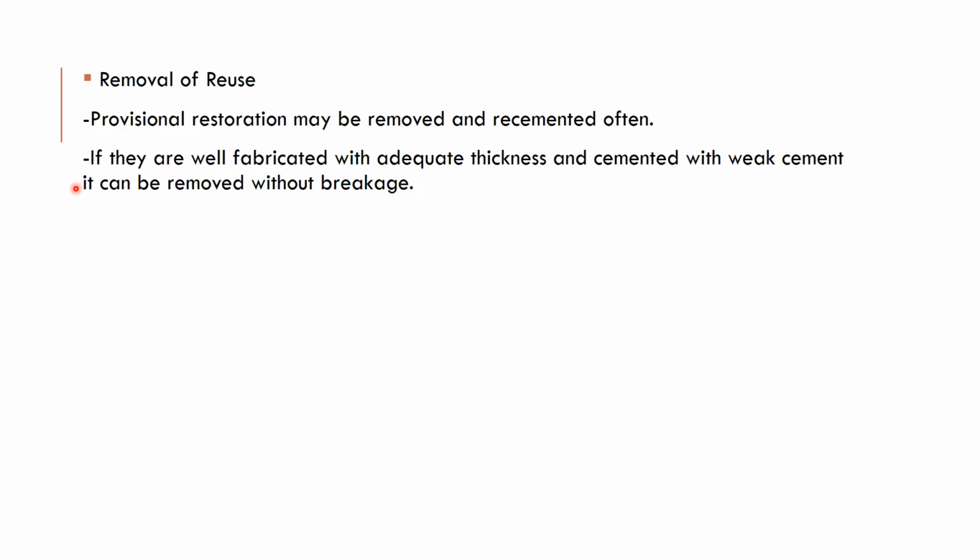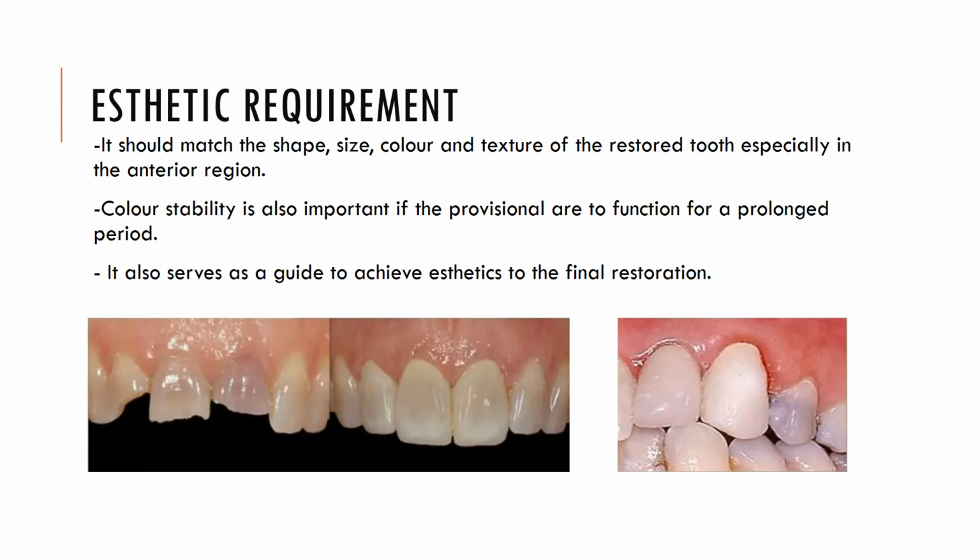Removal or reuse: provisional restoration may be removed and re-cemented often. If they are well fabricated with adequate thickness and cemented with weak cement, it can be removed without breakage. You don't really need to, but it can be.